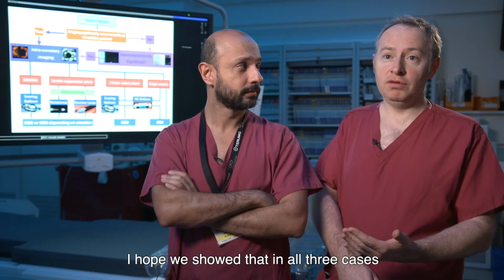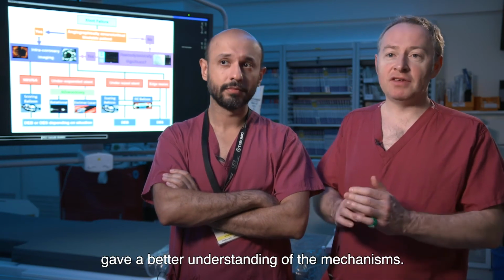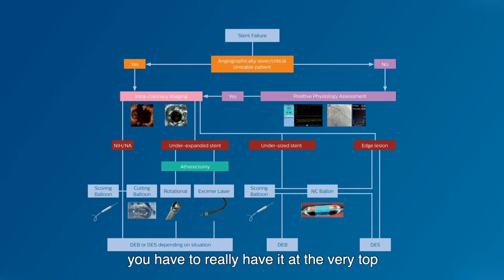I hope we showed that in all three cases the intracoronary imaging really gave a better understanding of the mechanisms. And going back to our chart, I think you have to really have it at the very top of the tree to understand what's going on, because there are a variety of mechanisms, and all three cases illustrated ones that we recognised and some we didn't really understand, even despite the imaging.